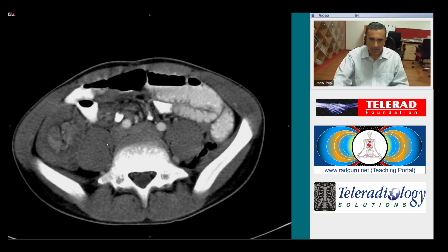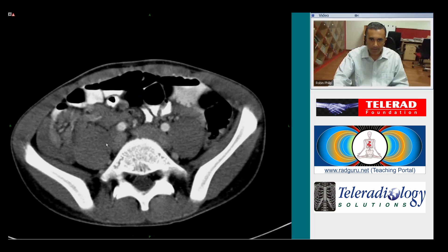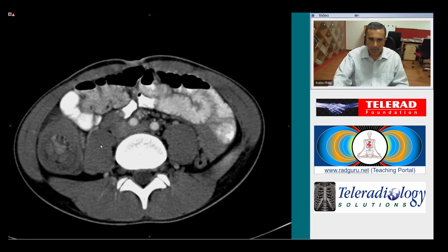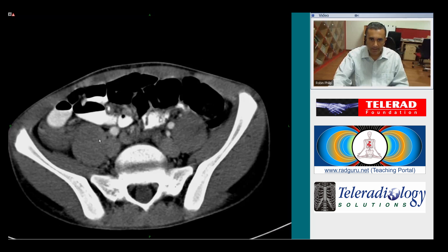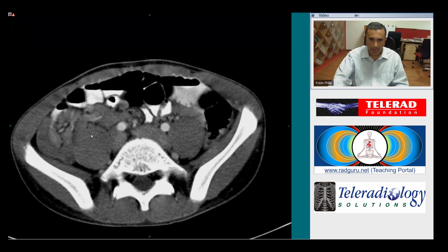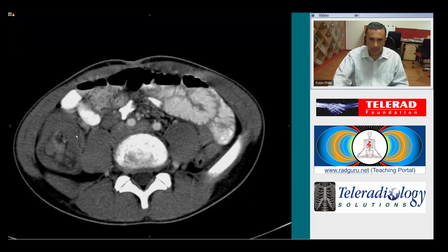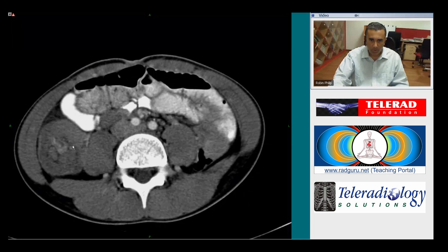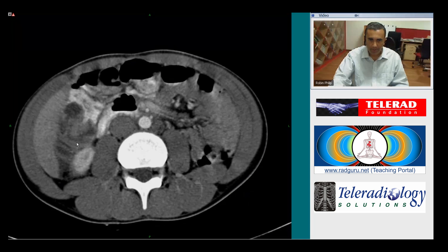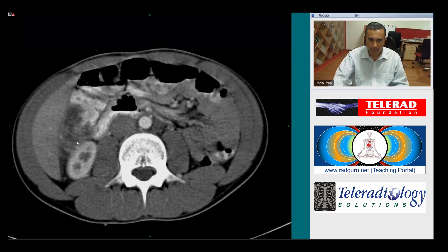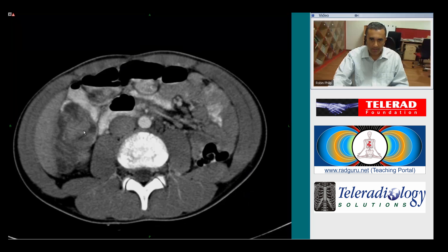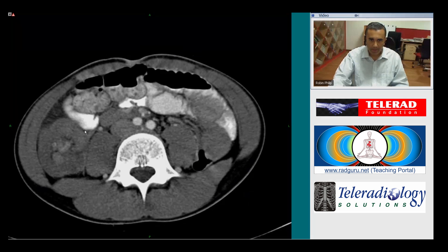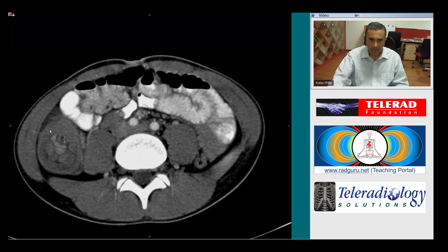So this is the typical appearance of an ileocolic intussusception. The terminal ileum has prolapsed into the ascending colon. This is the intussusceptum, and this is the intussuscipiens.